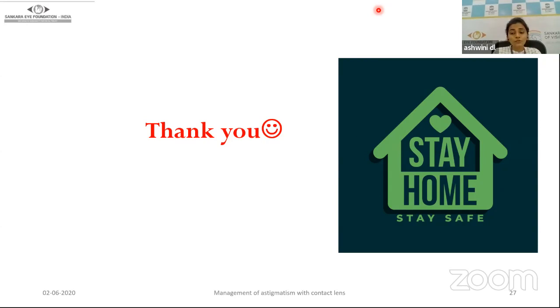You can look at the topography report of the cornea to see whether it is better to go with the RGP or still stick to soft toric. So based on that, you can decide.